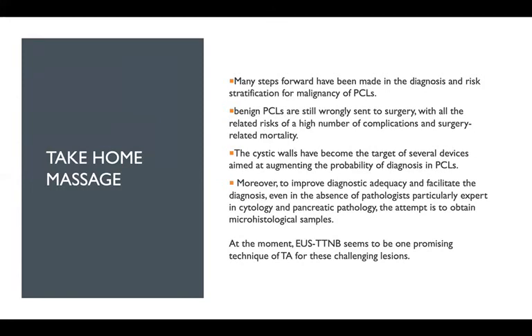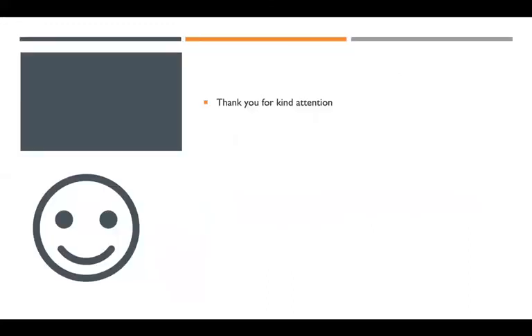Moreover, to improve the diagnostic adequacy and facilitate the diagnosis, even in the absence of pathologists particularly expert in cytology and pancreatic pathology, the attempt is to obtain a microhistological sample. At this moment, EUS through-the-needle biopsy seems to be one of the promising techniques of tissue acquisition for this challenging lesion. And thank you for your attention.